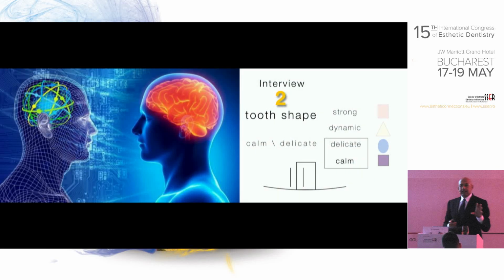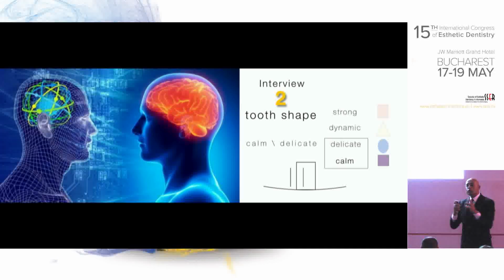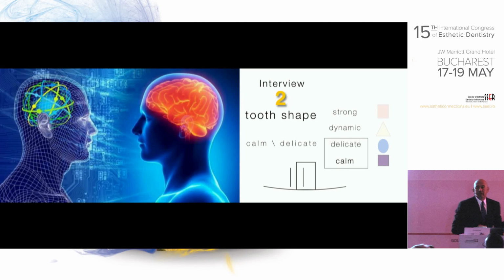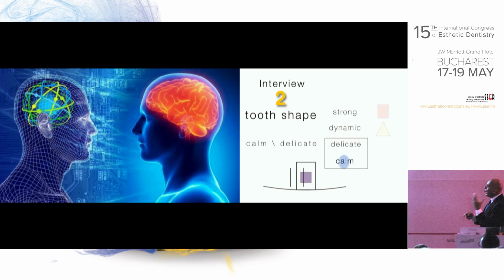And what is interesting is that, let's say in a patient we have mostly calm design, which is like a rectangular design, combined with delicate, which means some rounded shapes. So from the digital library, whether it be natural or from a ceramist, it picks up what we do here in Visage Smile, that we drag it, and I have the understanding, but at the end of the day, it was my hands to convert this into 3D.